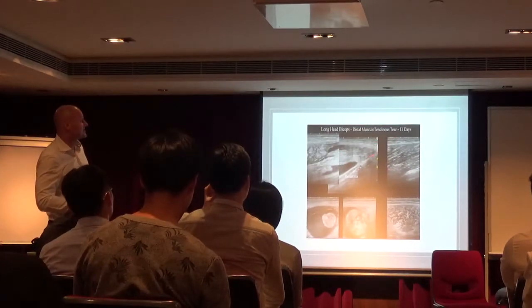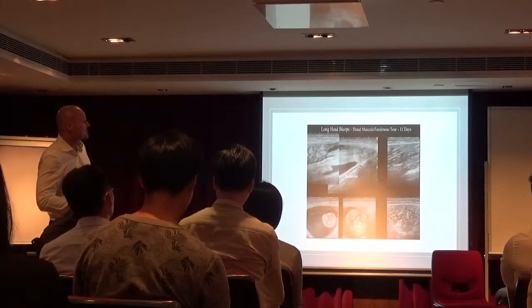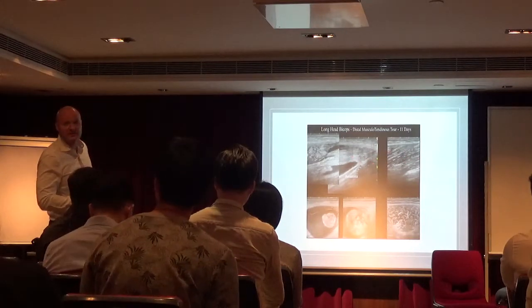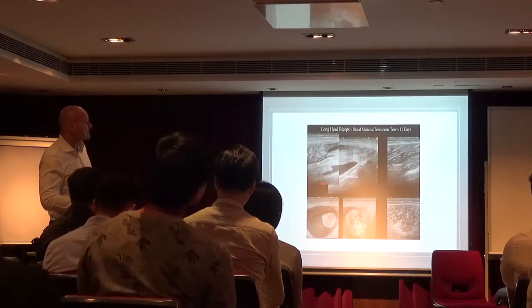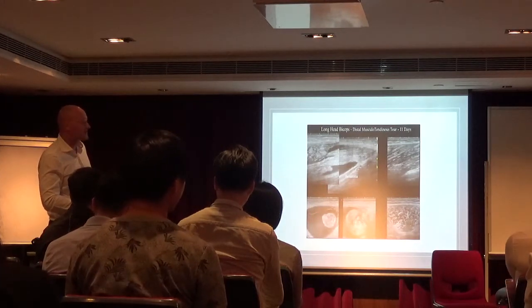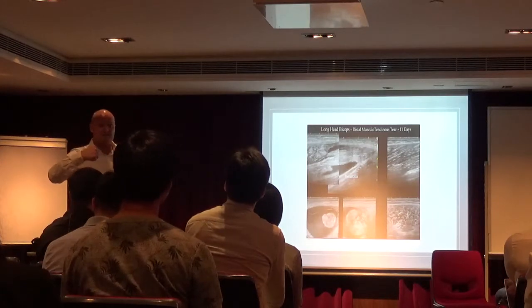Of the long head of the biceps. So you can see, this is normal. This is how it looks like — the tendon running down here in the tissues. You see the muscle fiber doesn't disrupt this. We only have fluid here, we miss the muscle. So we have retraction of the muscle belly.